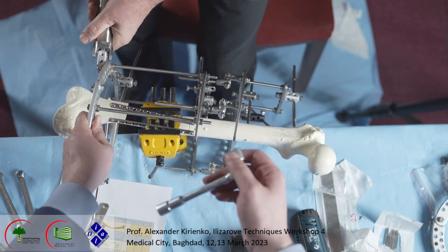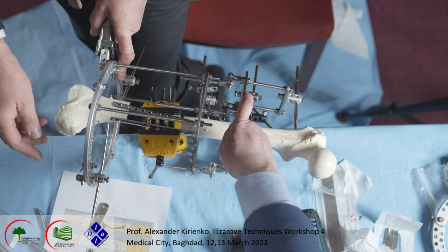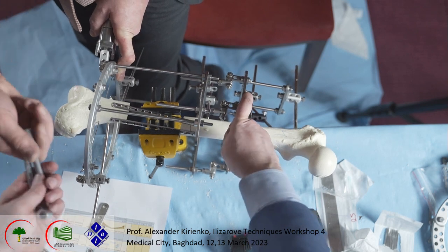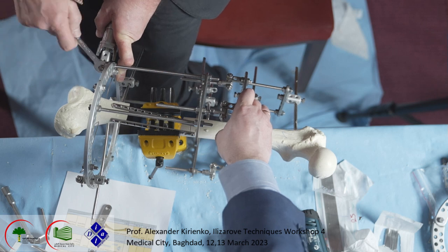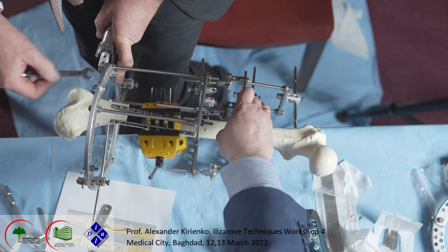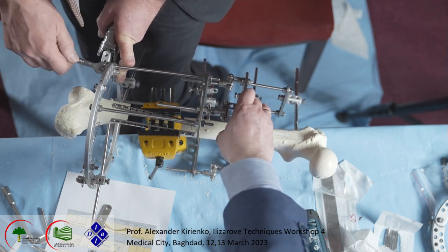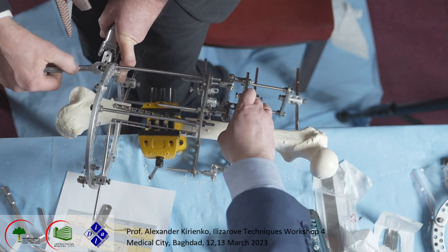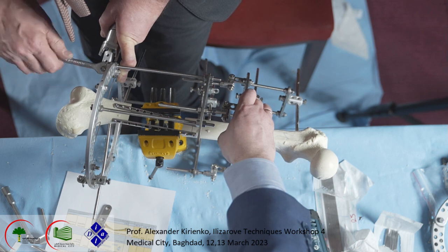The tension of this wire should not be so big, because the post doesn't resist so big a tension. Like I said before, maybe 80 kilos, not so much. But we put this wire oppositely, because in this way they fix better the distal part of the femur. The more this wire is distributed in half pins, the better the stability for the fragment.